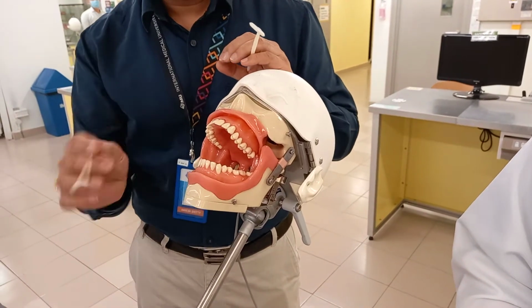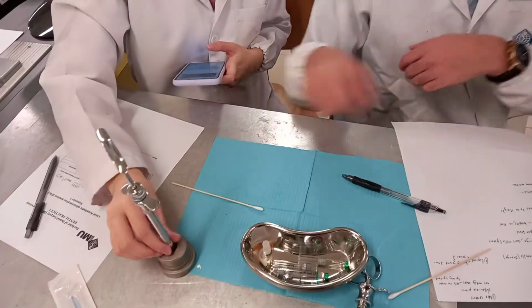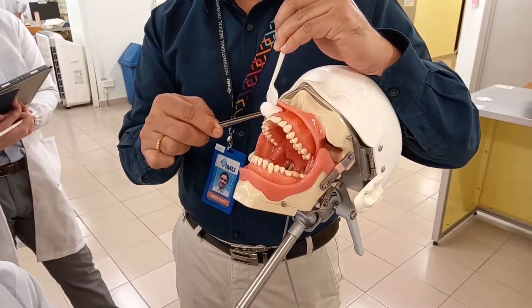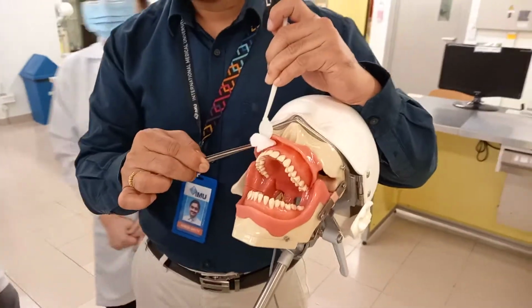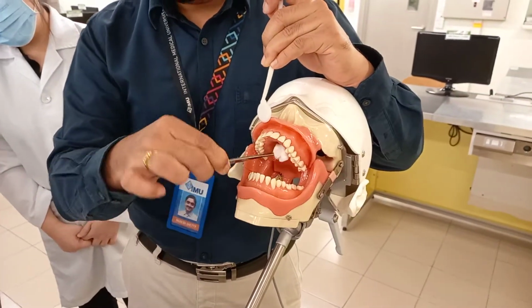Once done, you throw this, then you take your needle. Then you take this. Retract. You have to remove the topical. If the topical is there, you can't see your point of entry because it will be all smudged everywhere, mixed with saliva. So you remove the topical both here and here.